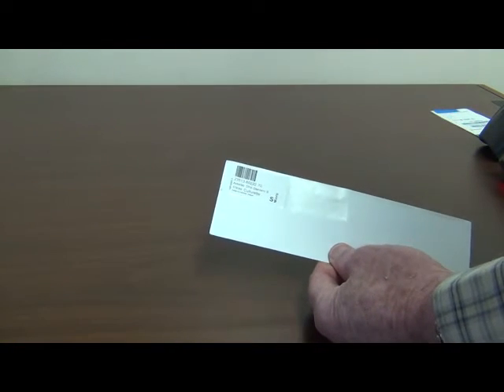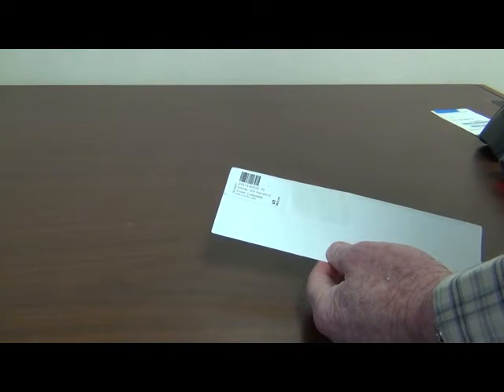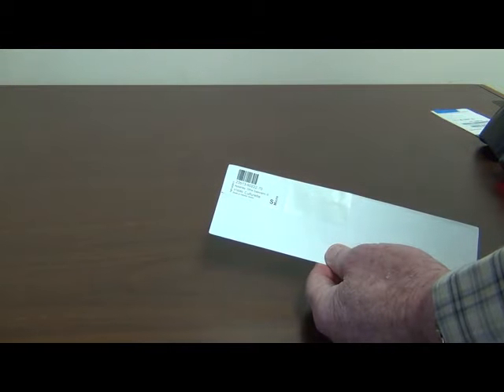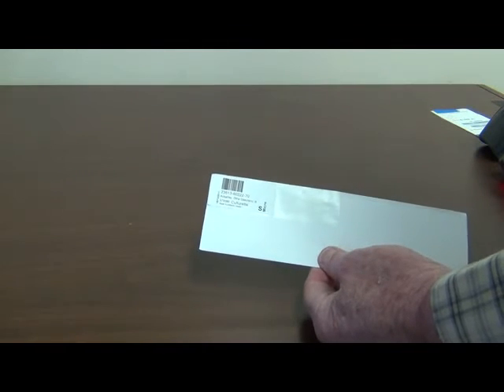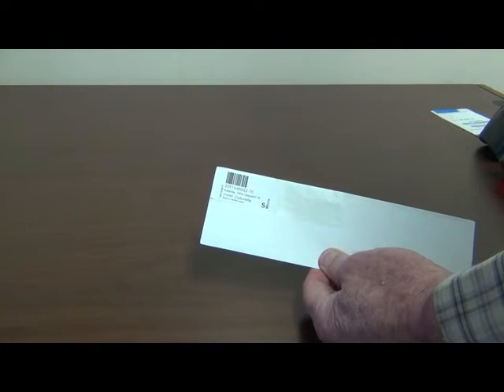So if you don't see anything obvious with your eye, then you should use a verifier to check the ISO quality of the barcode. That'll tell the detail of what's wrong with the barcode, what characteristic of the barcode caused it to fail. And you can share that information with the manufacturer, whoever printed the barcode, or it may be, like this, a lab sample that was printed within the hospital. So if it's bad, you send that report to whoever printed it.